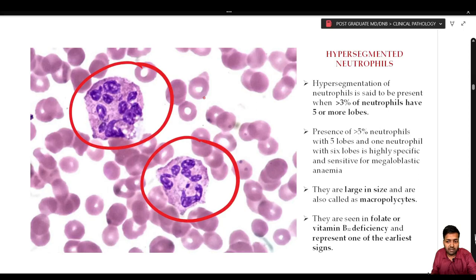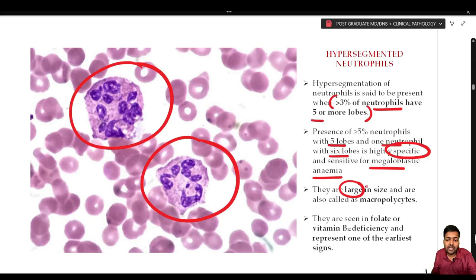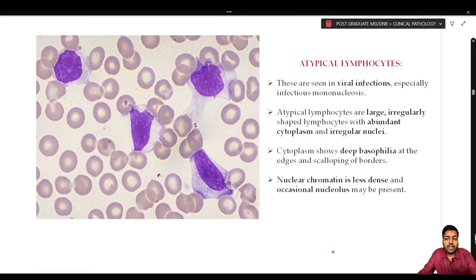Hypersegmented neutrophils are especially seen in megaloblastic anemia. Hypersegmentation is said to be present when more than 3% of neutrophils have five or more lobes; presence of more than 5% of neutrophils with five lobes and one neutrophil with six lobes is highly specific and sensitive for megaloblastic anemia. These large neutrophils are also called macro-polycytes and represent one of the earliest signs of folate or B12 deficiency.